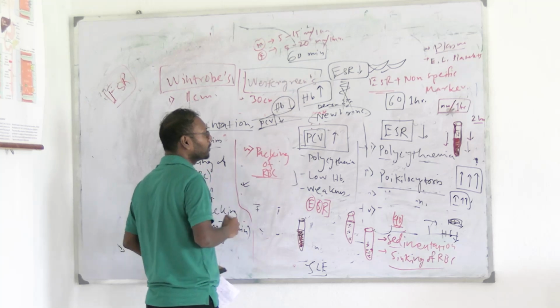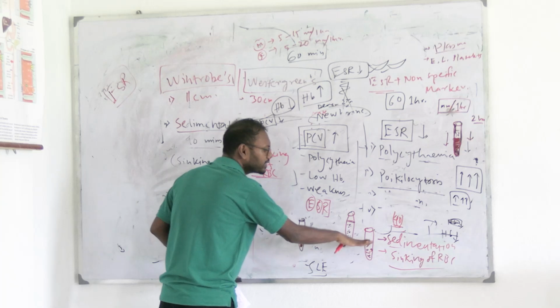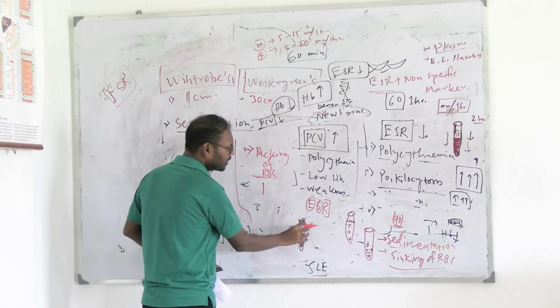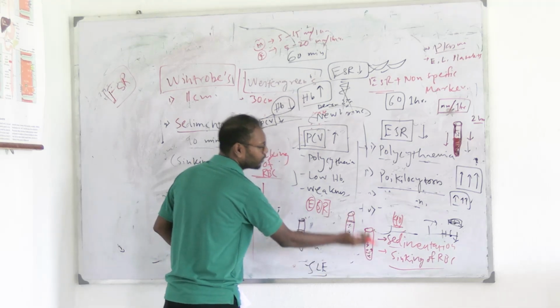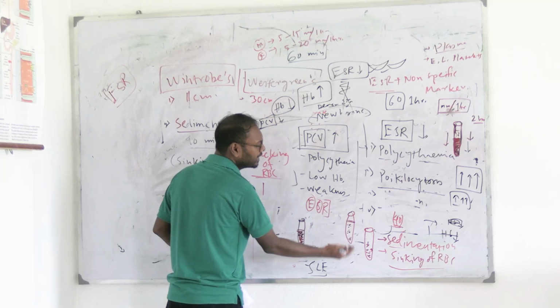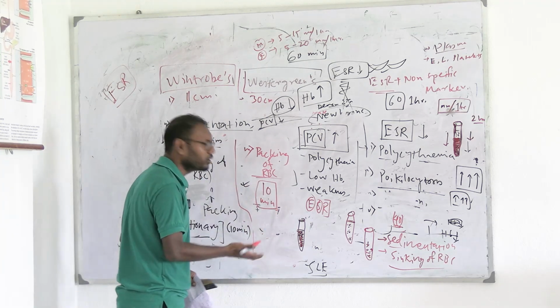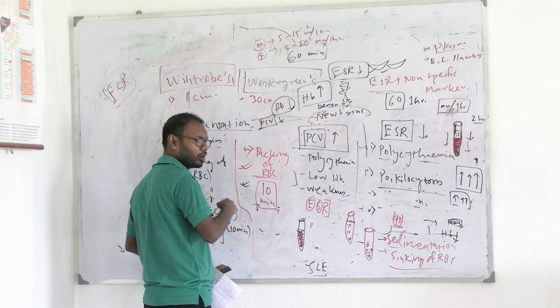So this packing of RBC is happening. If this packing doesn't happen, they will not be stabilized at the bottom of the test tube. So what will happen? If there is a little bit of vibration, a little bit of movement of the test tube, they will again get dislodged from the bottom, and they will mix up with the fluid again, then they will get up because they are not stabilized. So this packing procedure is also very important to make the sediments stick down below the test tube, getting clamped to each other. So this is the third procedure, packing of RBC.